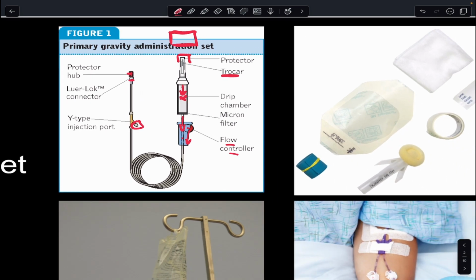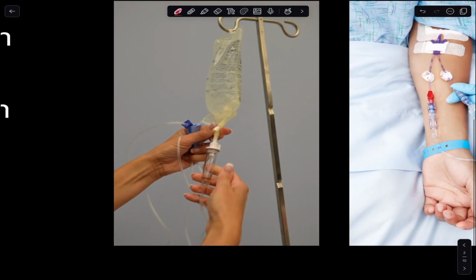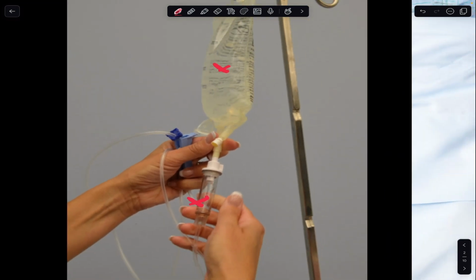So to assemble this fluid set, all that you would do is grab a bag of fluids like this. You would grab your tubing like this. On your fluids, it's not shown here, but initially there would be a blue cap on this piece right here that you're pressing the trocar into, and you would peel that blue cap off. You'd take the cap off of this trocar as well, and then you just firmly press the trocar up into the fluid bag there. This port right here is to administer medications through, so that's not going to accept the trocar. You're going to need to make sure that you're pressing the trocar up through the acceptor site that had the blue cap on it and that fits the trocar appropriately.